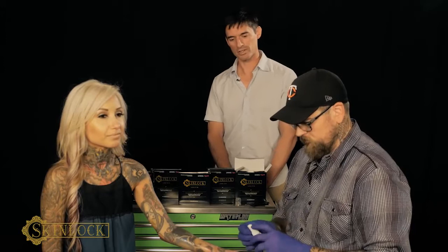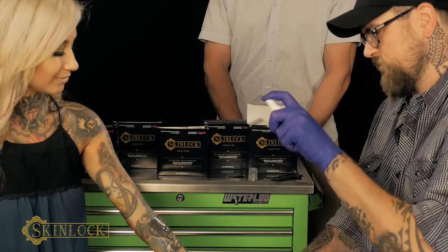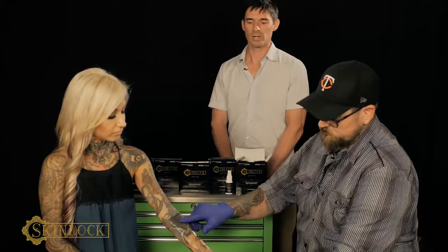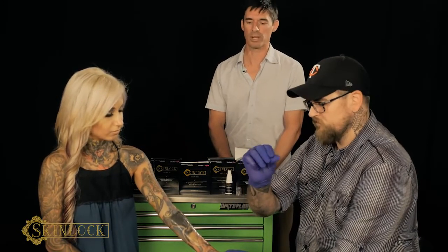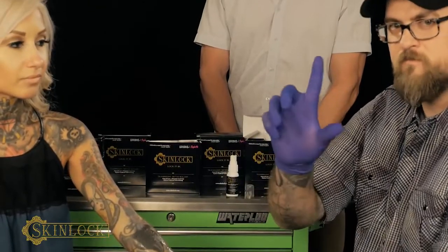So what Alex is going to show you now is we have a spray that contains a film forming agent, and we need to use a very small sparing amount of the spray, typically applied 12 to 18 inches away from the skin. So a little further, we're about there. And so Alex is going to show you just a light mist of the spray. That's all you need. So I'll show you at this point, it looks wet on the camera, but in fact this is actually a rubbery, transparent membrane that you can touch with the skin without tearing it.